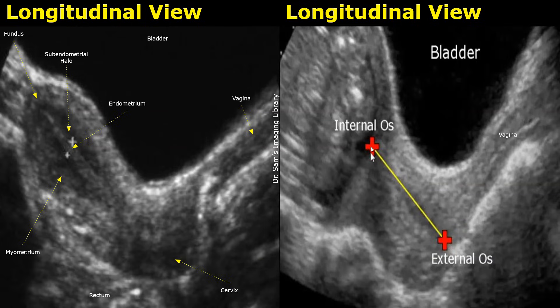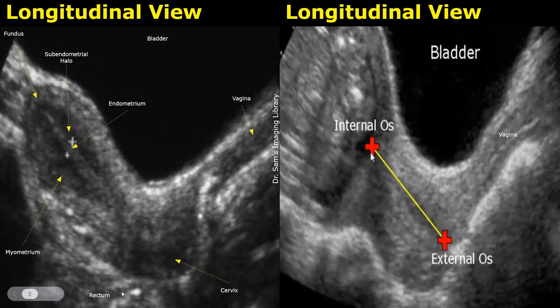The external os is the junction between the cervix and the vagina. This is the vagina. It has a somewhat striated appearance with some thin, linear, echogenic lines. The rectum is present posterior to the uterus, in this area.